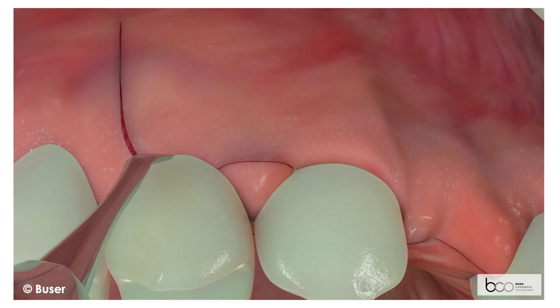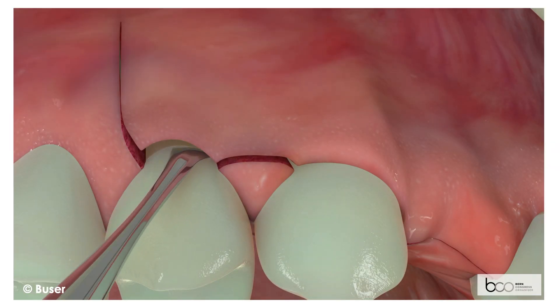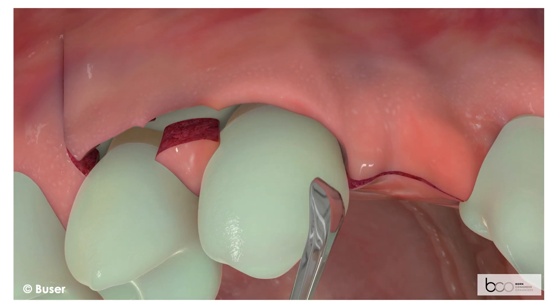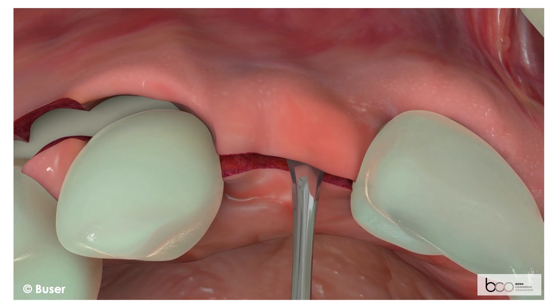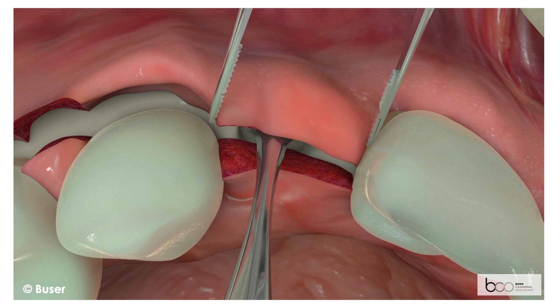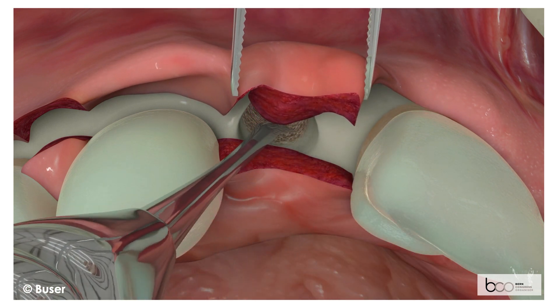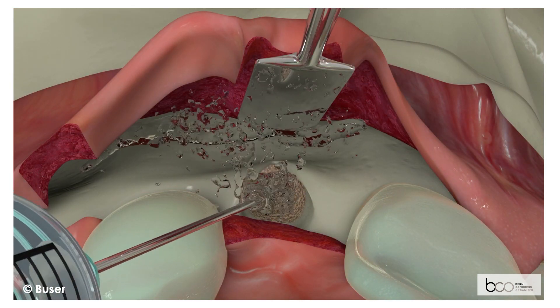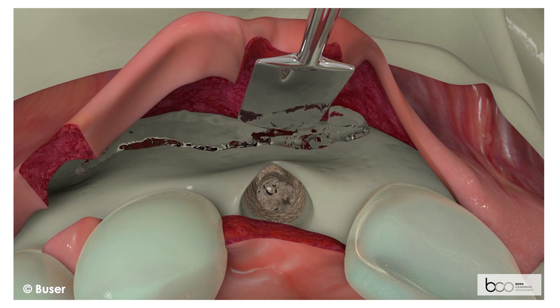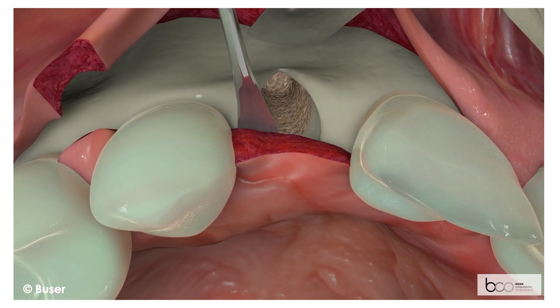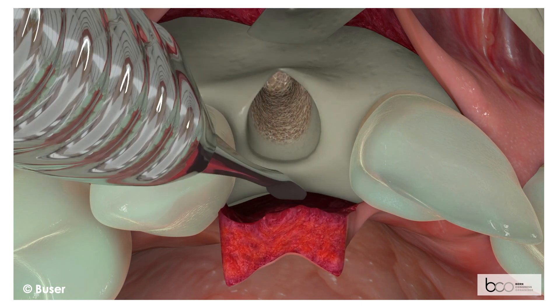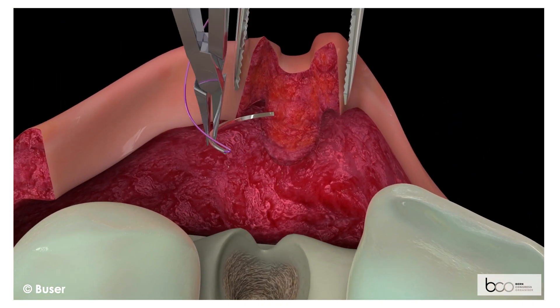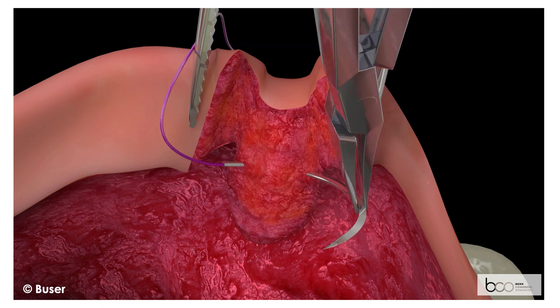The mucoperiosteal flap is now carefully elevated with a fine tissue elevator. In the extraction site, the soft tissue within the former extraction socket is mobilised as part of the buccal flap, providing a thick soft tissue biotype in the future implant site. The surgical site is exposed and irrigated with sterile saline. The palatal flap is also elevated to expose the palatal wall of the bone defect, and a retraction suture is applied to keep the flap off the surgical site during implant surgery.